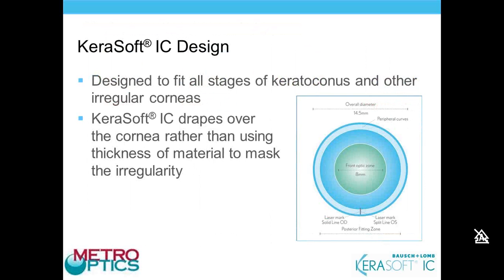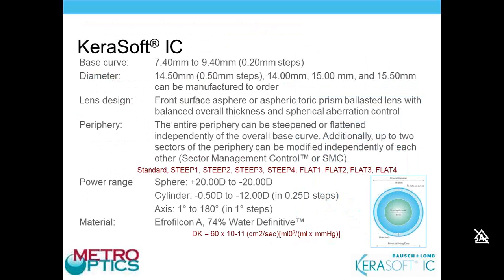As a result, you will have a cylindrical component come through in your over-refractions. So this lens is a very powerful soft toric lens because you are able to put that cylindrical component into the correction of this lens. I apologize for this slide being so busy.